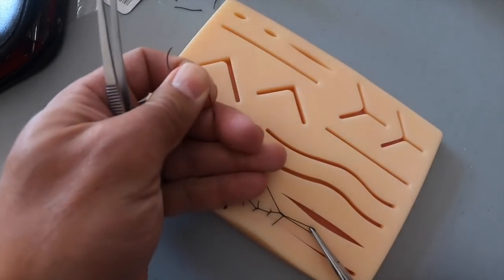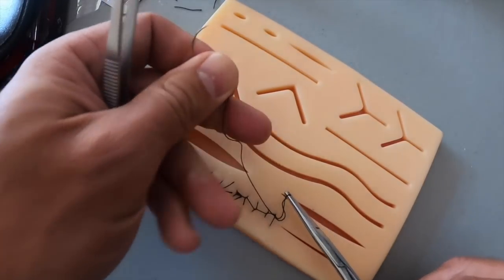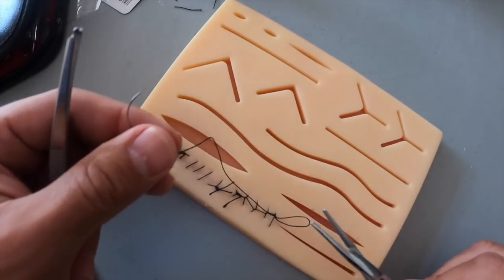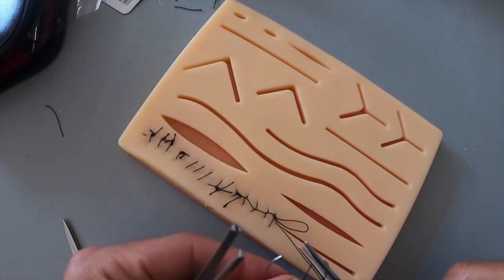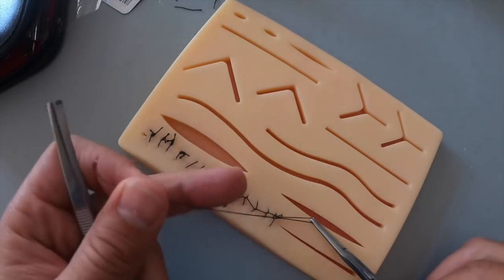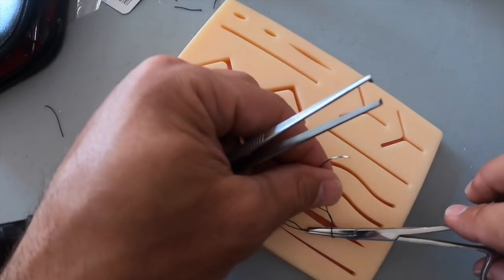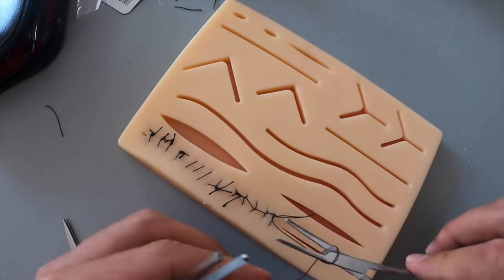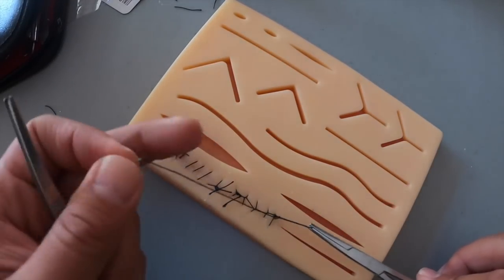And just like before you can kind of fasten it so it doesn't unravel like so. Grab and pull, grab and pull forward, grab and pull backwards, grab and pull.